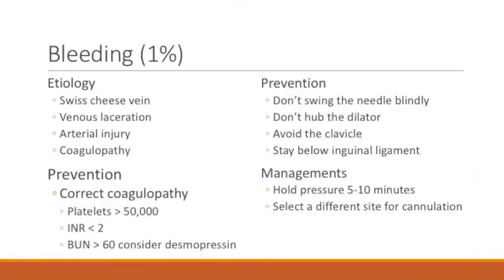If you do cause bleeding, usually holding pressure for 5 to 10 minutes will correct it. And then often you'll have to select a different site for cannulation because the hematoma can obstruct your view of the vein.